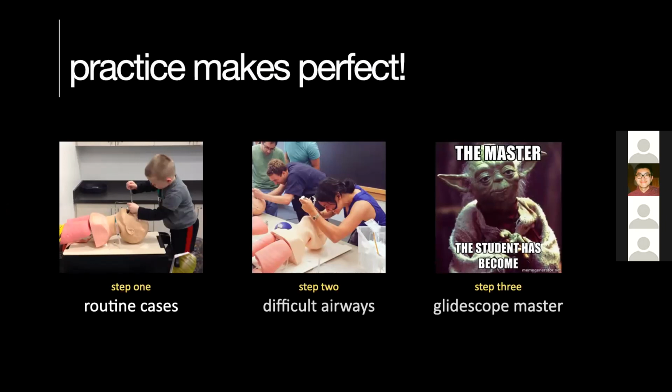You should start first using it for the routine cases. So those trauma intubations that you think are going to be very easy, the intoxicated drunk person that you anticipate to be an easy airway. And then you go to the difficult airways, the bad mandibular abnormality, the person who has no neck, no chin, and no cervical motion. This is where you want to use it after. And then you become a Glidescope master, because you encounter multiple scenarios where you were able to troubleshoot. So don't forget that you need to practice, even though it's one of those devices that is a little bit easier to use.